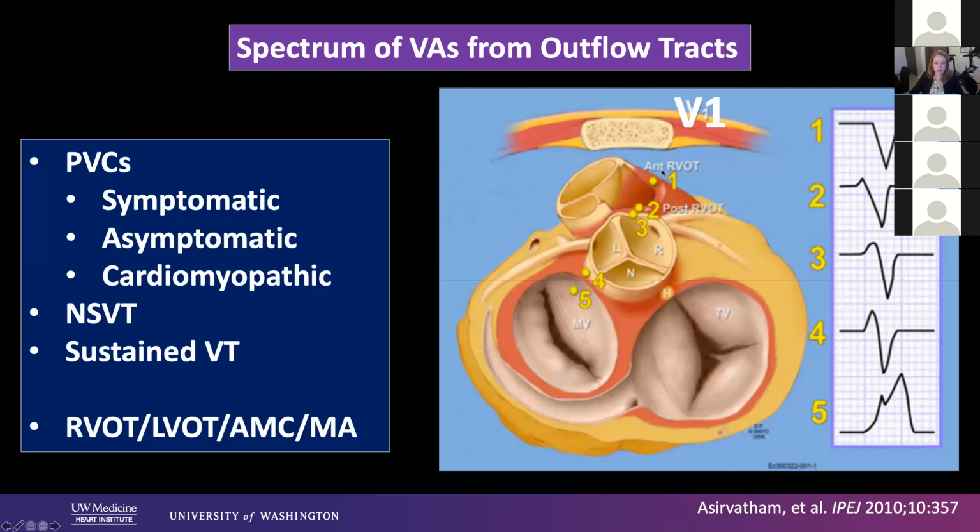Basically, looking from anterior to posterior and from rightward extension to leftward extension from the perspective of the EKG lead V1. So what's going to happen, and we'll get into more detailed EKG criteria, but V1 ends up really being what I call the lead that will embarrass you, basically. So if you don't pay attention to lead V1, if you don't pay attention to disparities in your pace map or disparities in the morphologies in V1 in the lab, you will end up with a long day.